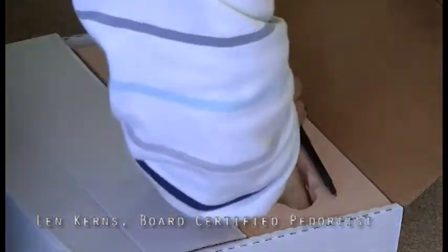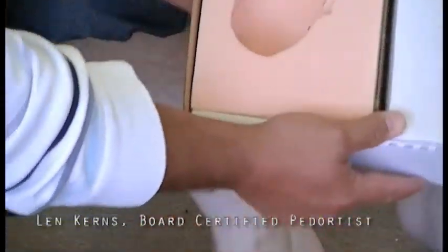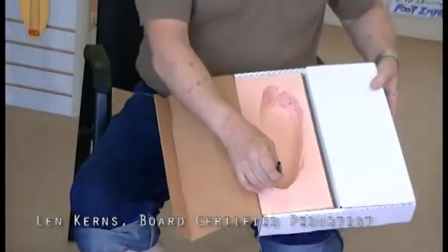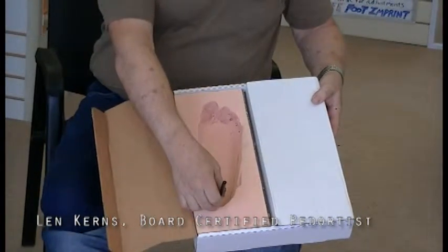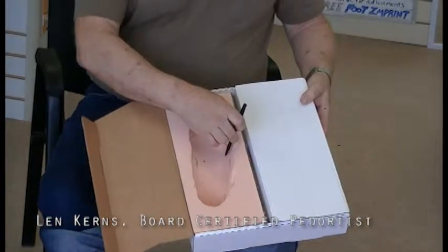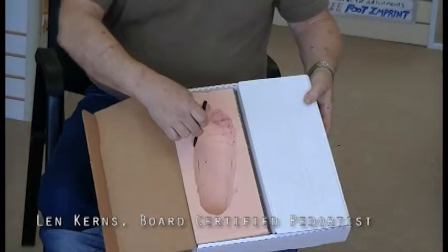That's better. Okay. Now again, there's a couple ways to check yourself out. I took my cell phone out of my pocket, but if you have a cell phone, you can put it down into the box, put your finger against it as a quick measurement, and see if this is high, all right? And you can see the varus coming uphill here.